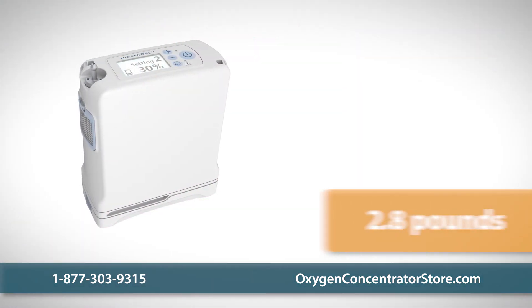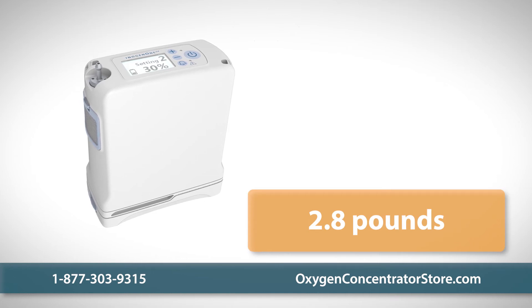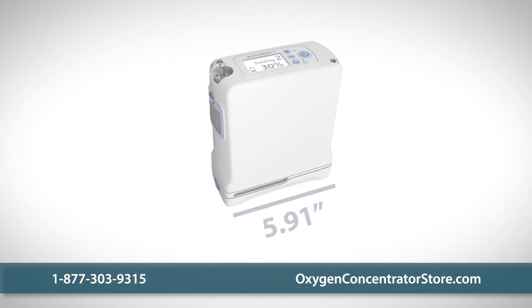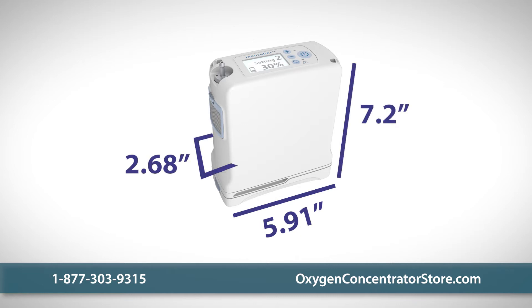One of the most portable units on the market, the G4 weighs less than 3 pounds with a battery and measures 5.91 inches wide, 2.68 inches deep, and 7.2 inches high — the size of a paperback book.